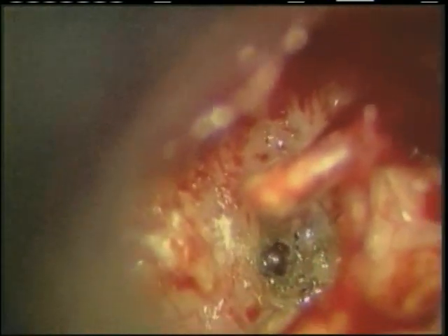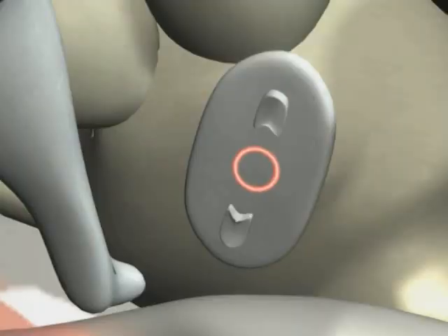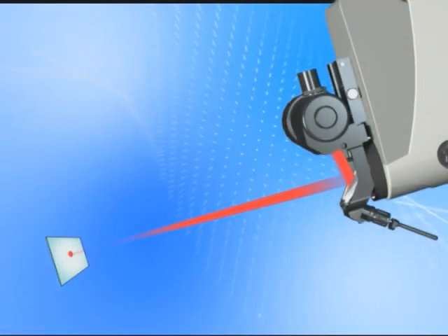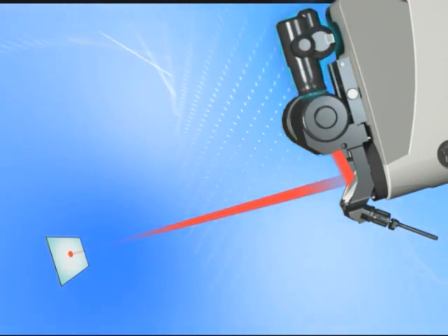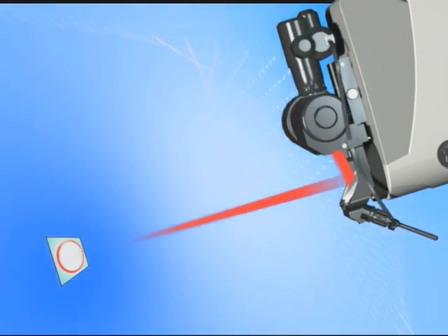The rosette pattern forms the larger fenestra in the stapes footplate. An elegant advancement of this laser procedure is known as the one-shot stapedotomy. In this case, a robotic scanner which automatically moves the laser beam is added to the micro manipulator.